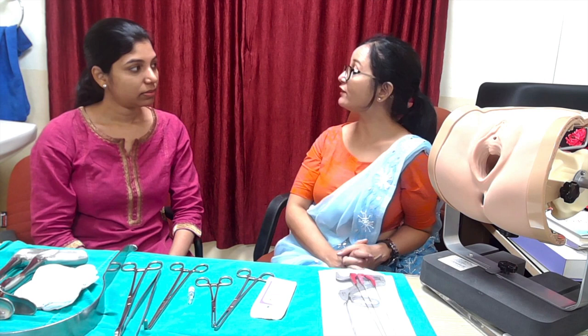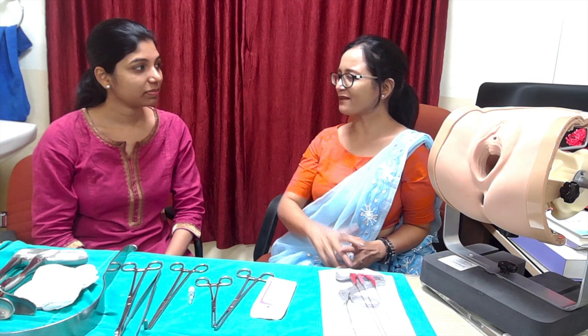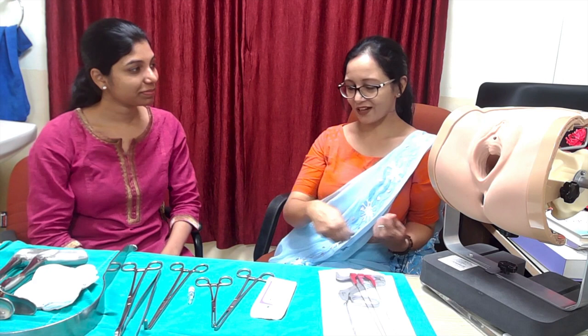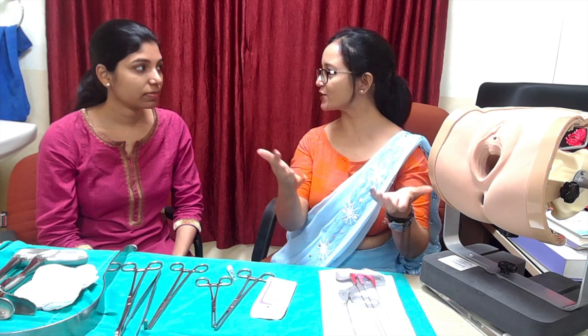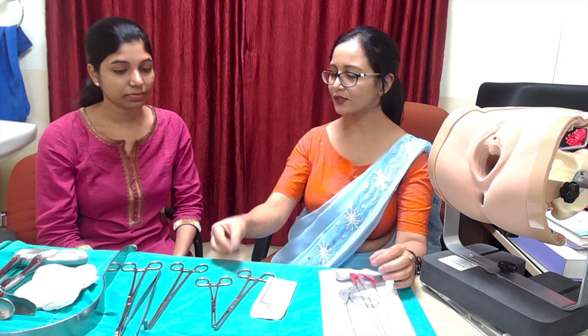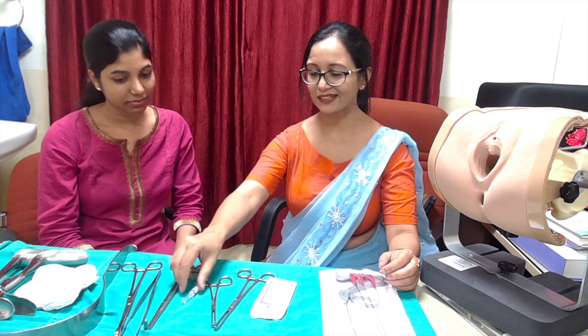We operate on the right side because the sigmoid colon and rectum are on the left, and it is also technically easier on the right side. The angle of hydrodissection infiltration is towards the right, not into the center. An important tip: do not infiltrate more than 30–40 ml of adrenaline solution in this space.